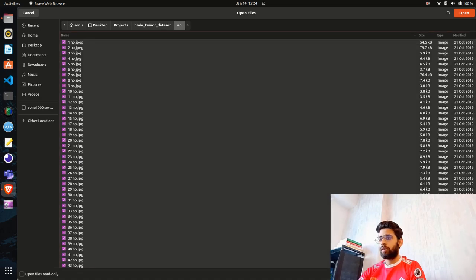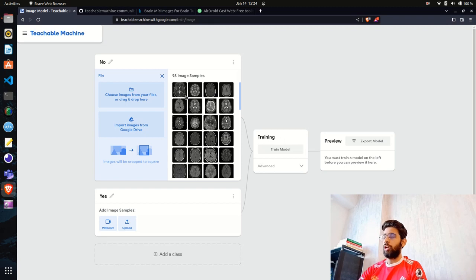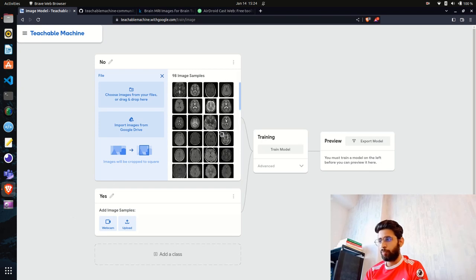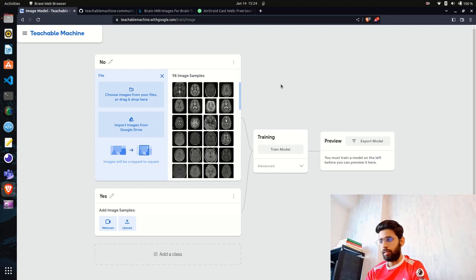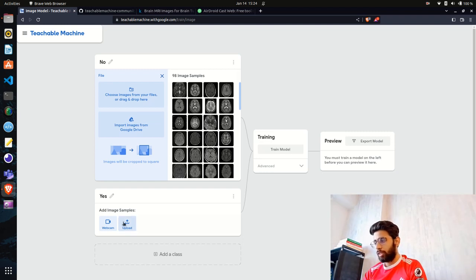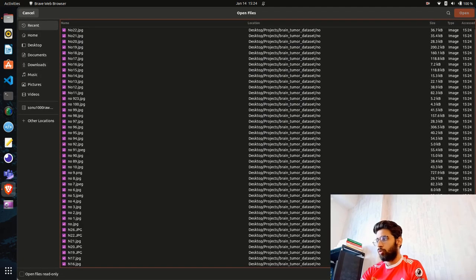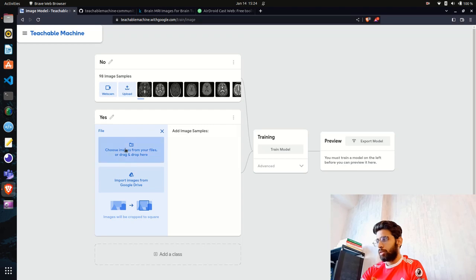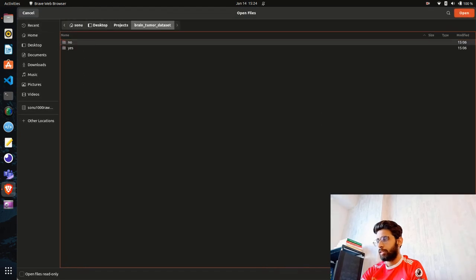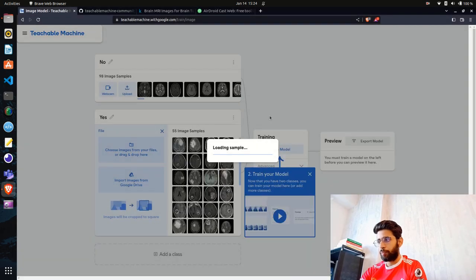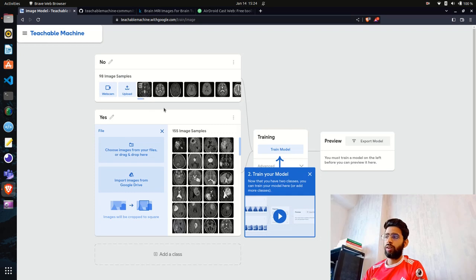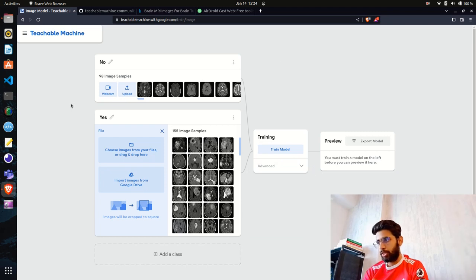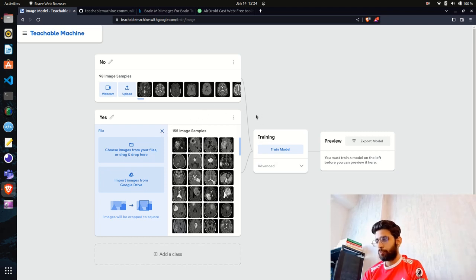I'll open the 'No' folder and click Open — it's uploading all the images. You can see 98 image samples. It says images will be cropped to square, so preprocessing is handled in the backend. For 'Yes,' I'll do the same — uploading those images as well. I have around 100 'No' and 155 'Yes' samples, which is a reasonable balance.